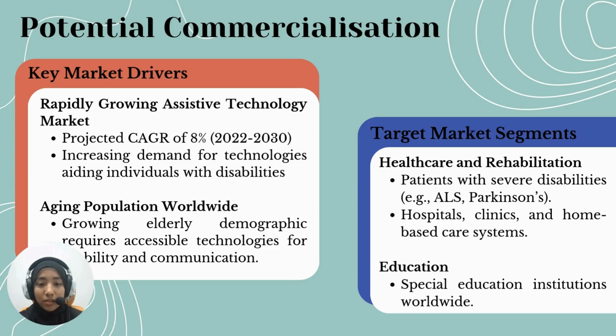Our target market focuses on two critical segments: healthcare and rehabilitation, as well as education. In healthcare and rehabilitation, OptiCom is designed for patients with severe disabilities, such as those affected by LIS, ALS, or Parkinson's disease.